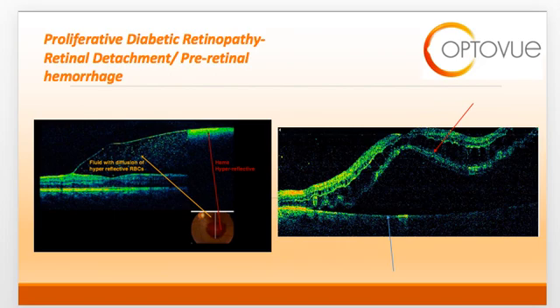Neovascularization can also lead to tractional retinal detachments, resulting in a separation of the neurosensory retina from the underlying RPE. The red arrow on the slide to the right is pointing to the neurosensory retina. The blue arrow is pointing to the RPE. You can see that there is a complete separation from the neurosensory retina to the underlying RPE. In this particular case, the macula is involved, so we would call this a macula-off retinal detachment.